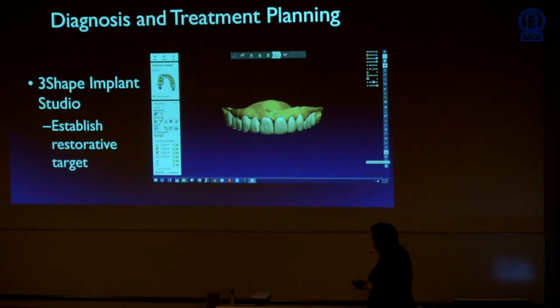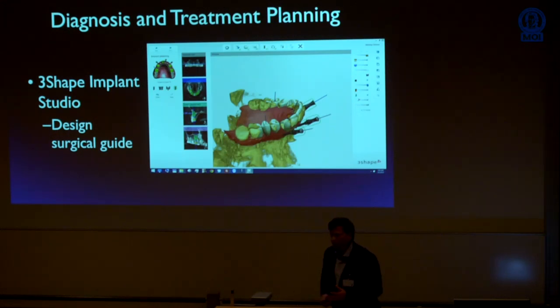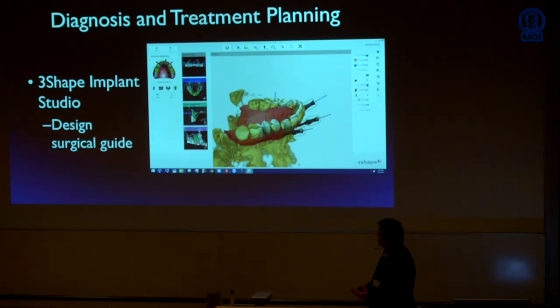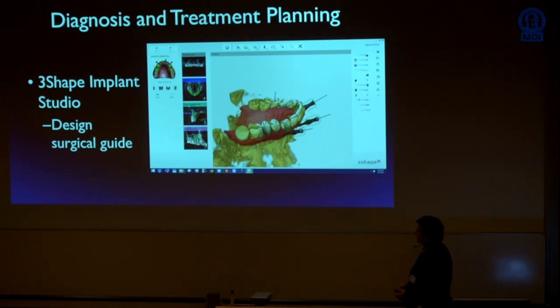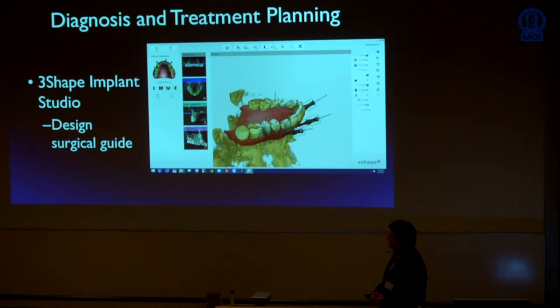restoratively. When I get to this point, we figure out what our implant positions are going to be. We have to be very careful to be compliant with accepted principles of restorative design. We need to put our implants so that we allow enough vertical restorative room for our multi-unit abutments, so that we leave enough room for materials. So we find very rational implant positions, and from that we predetermine angles of multi-unit abutments. And we design our surgical guide.